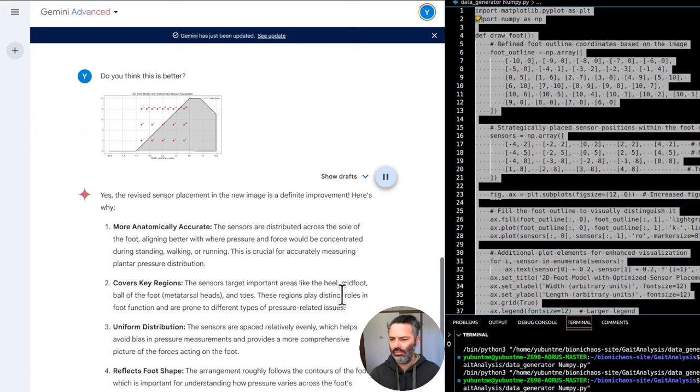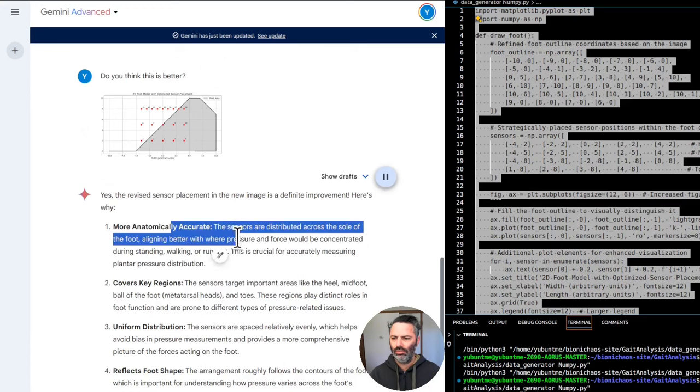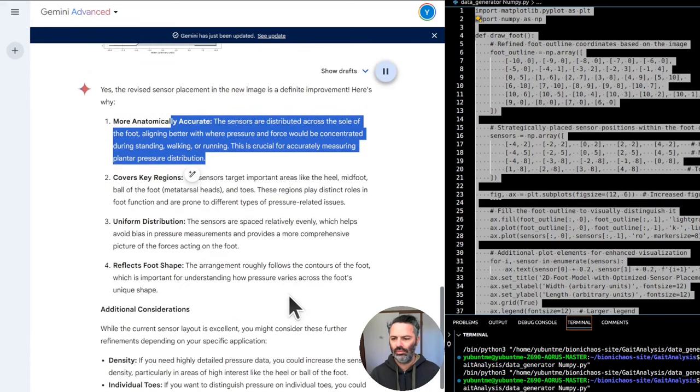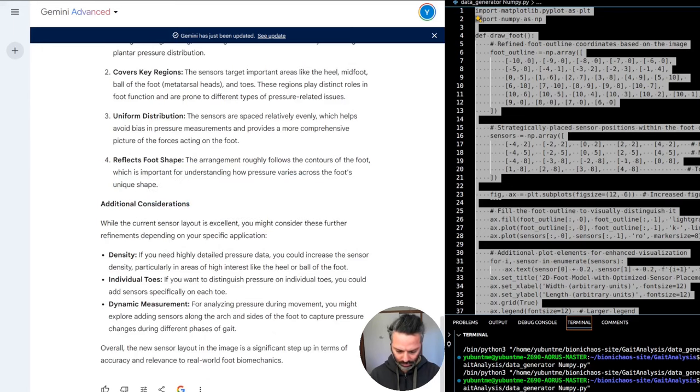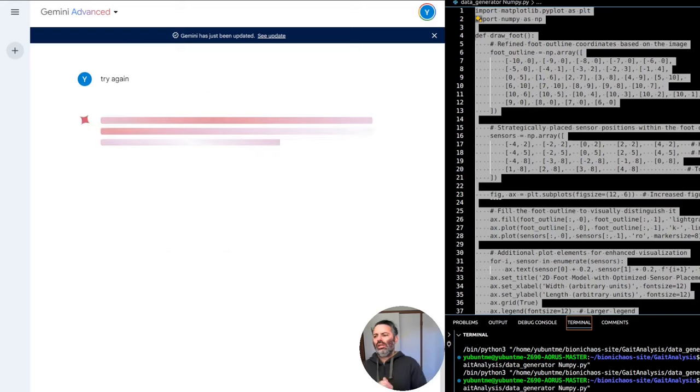Yes. The revised sensor placement in the new image is a definite improvement. Here's why. 1. More anatomically accurate. The sensors are distributed across the sole of the foot, aligning better with where pressure and force would be concentrated during standing, walking, or running. This is crucial for accurately measuring plantar pressure distribution. 2. Covers.